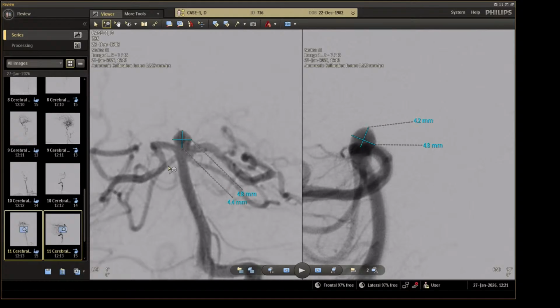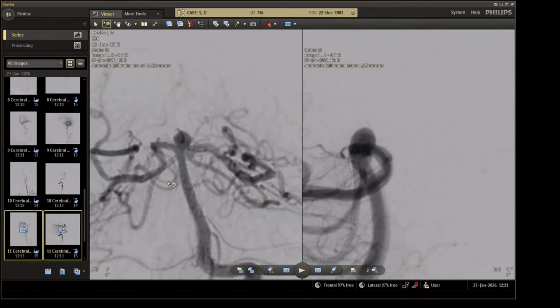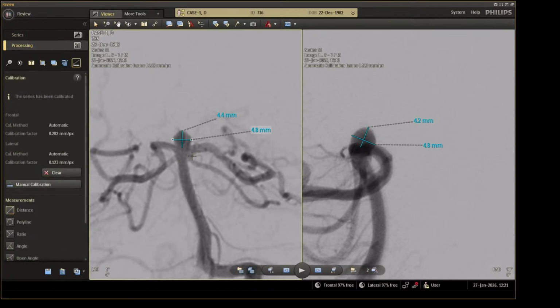We'll try to do balloon-assisted coiling for today. If it's needed on the follow-up, maybe we'll place a stent at the second session. Because of the two territories, I prefer to place the stent in a delayed manner.